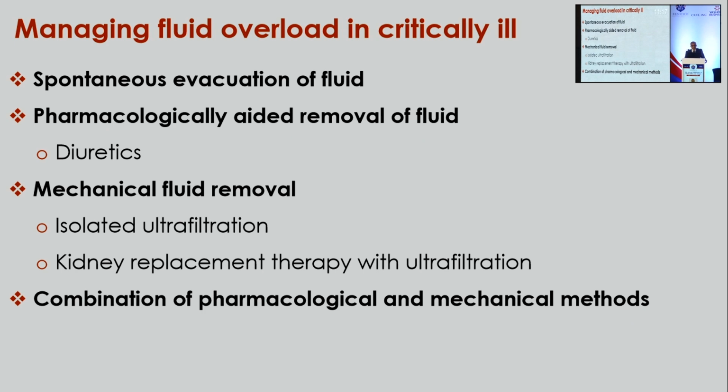Of course, patients who do not develop AKI and have preserved kidney function could have a spontaneous evacuation of this fluid. Sometimes we need to aid this pharmacologically, but many times we would need to bring in mechanical fluid removal strategies like isolated ultrafiltration or kidney replacement therapy with ultrafiltration. And seldom we may need to even use a combination of these methods to achieve our fluid balance goal.